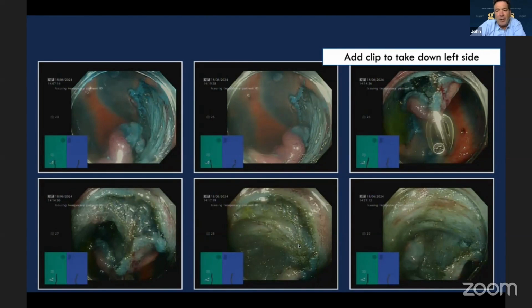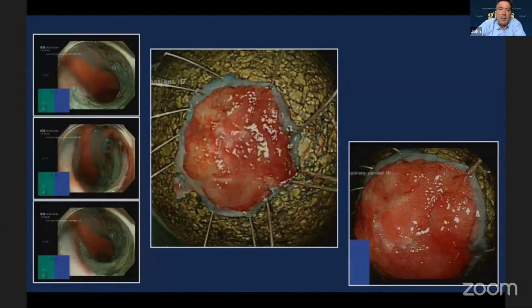And again, you see lots of fat in the submucosal space. And this just makes your life very difficult, gets very smoky. You get lens opacification, and you have to take the scope out and clean the lens. But it comes off and everything's fine, really.